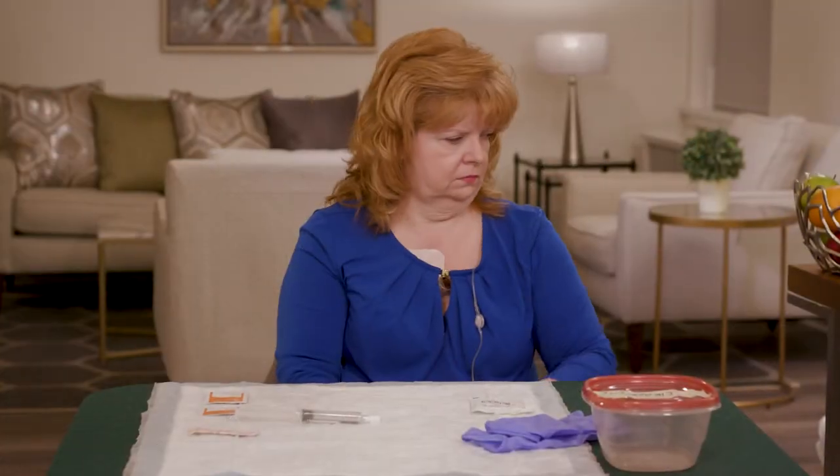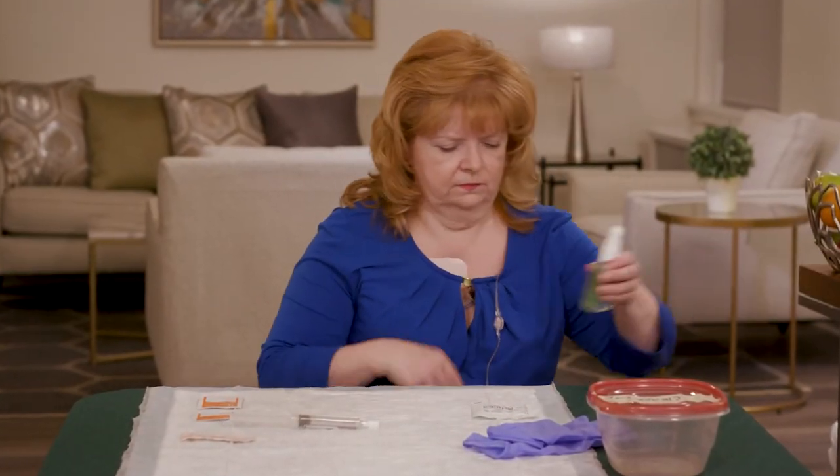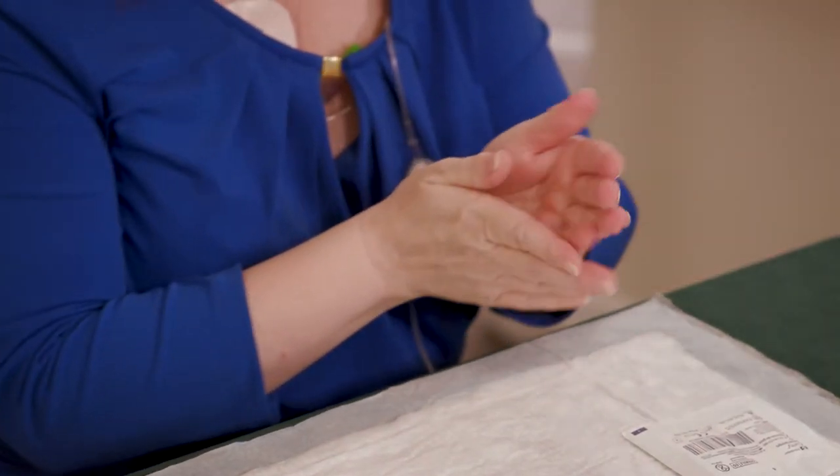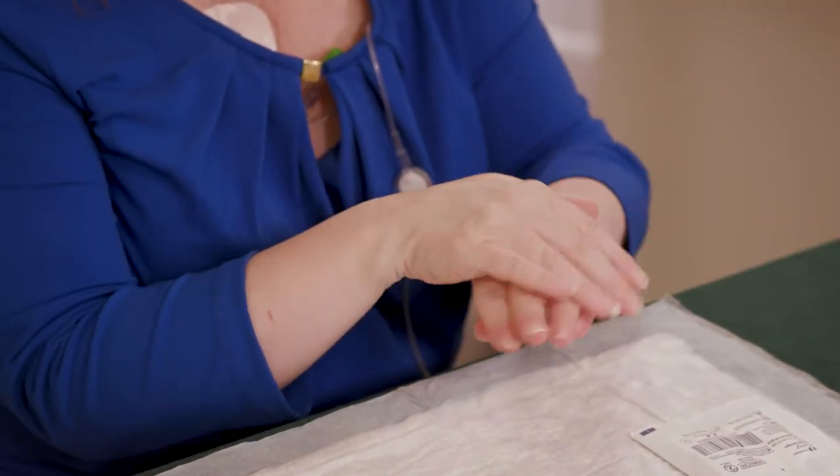If you're using an alcohol-based hand sanitizer, be sure to cover all parts of your hands with it, rubbing them together until they're dry.